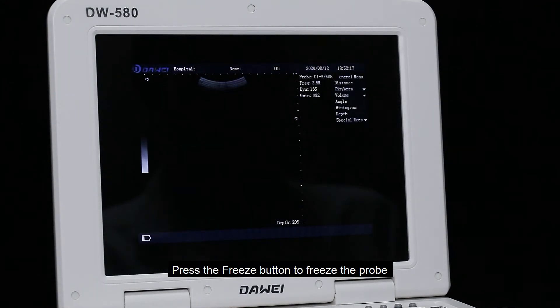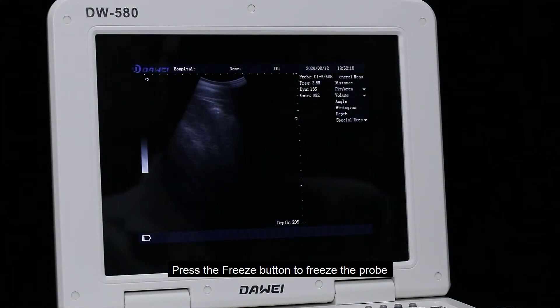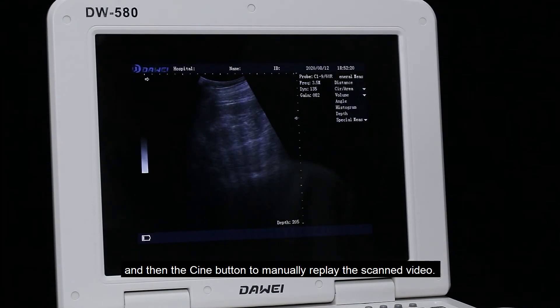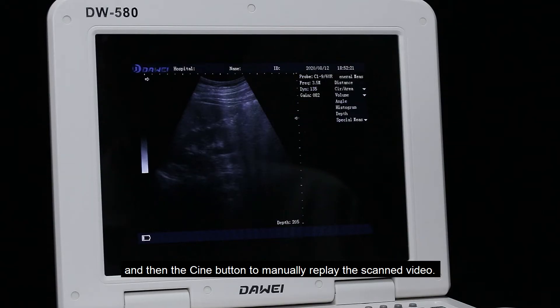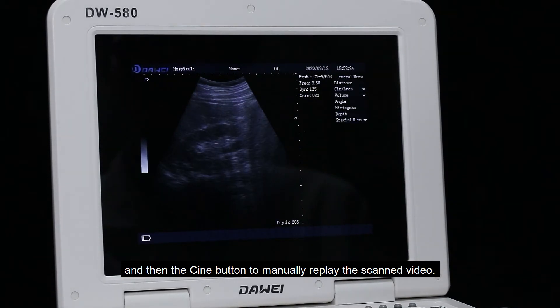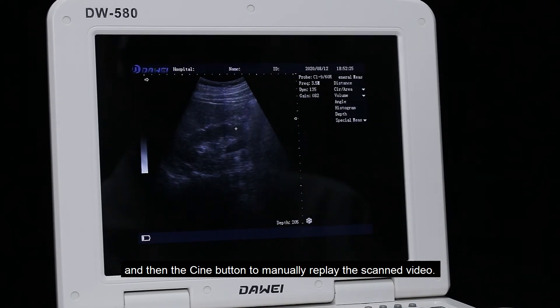Press the freeze button to freeze the probe, and then press the cine button to manually replay the scanned video.